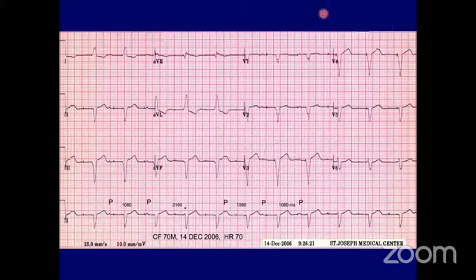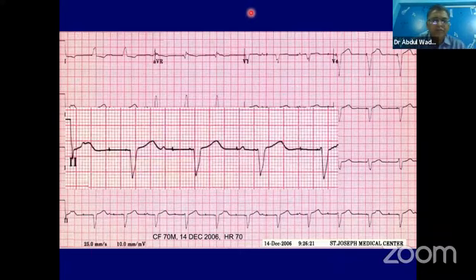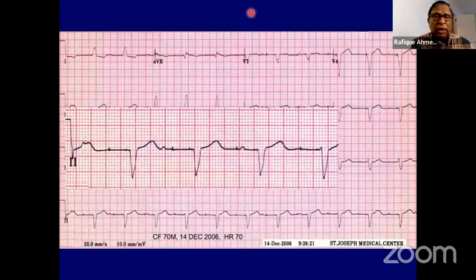Sir, I have a question. This patient, if he has good LV function, should he not make it VVIR? Well, the question is, how old is the patient? 70-year-old. Depending on how old this lead is, number one. If it is a newly implanted pacemaker, definitely I'm going to revise it.